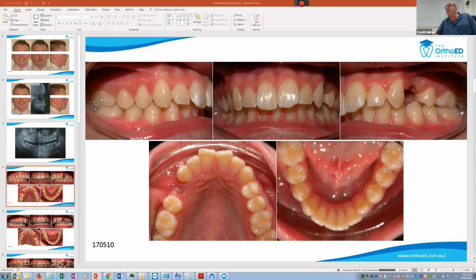So you put your brackets on so they're absolutely perfectly straight. That's a really good guide, because what we normally do is we put every bracket on and we look at it as an individual tooth, don't we? So when you bracket, you just look at that one tooth, and then you look at this other tooth. But what you need to do is look at the teeth in relationship to each other, because that's what you want to maintain, this good buccal occlusion. Does that make sense? Yep.